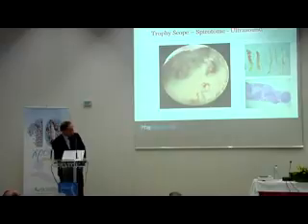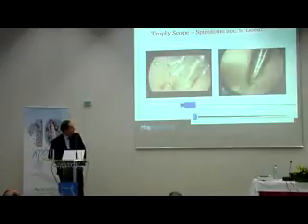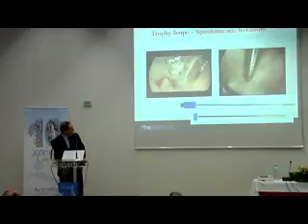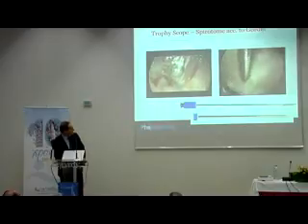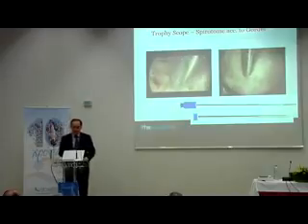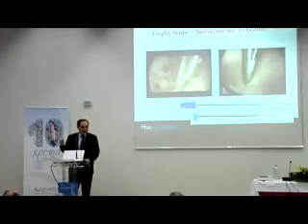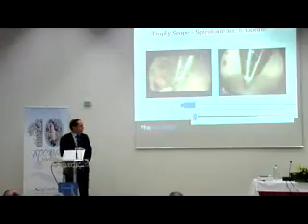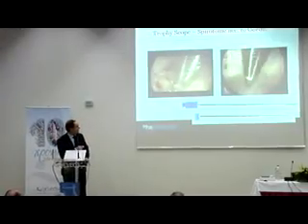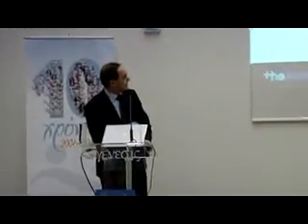And here we have done 2 samplings, and you see the corkscrew and the cutting device under hysteroscopic vision. If you know that this is 1 centimeter, and you measure the thickness of the wall, and you know the wall is 2 centimeters, there is no risk. You can make your cutting, and you have an absolutely perfect sampling.